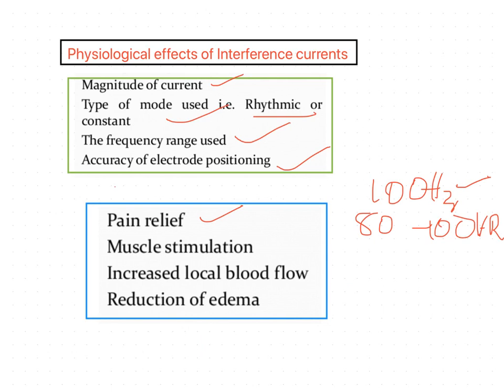And if you activate the descending pain suppression system, a frequency of 15 Hz is required, and the stimulation of small diameter fibers produced will eventually cause the release of endogenous opiates like enkephalins and beta endorphins at the spinal level. So you people know that.